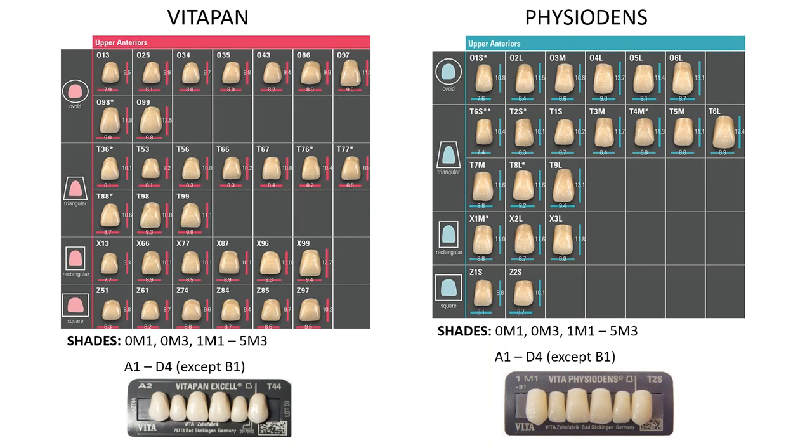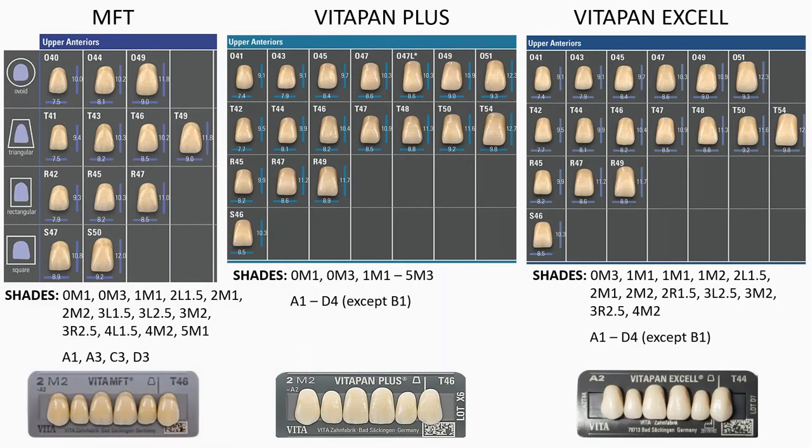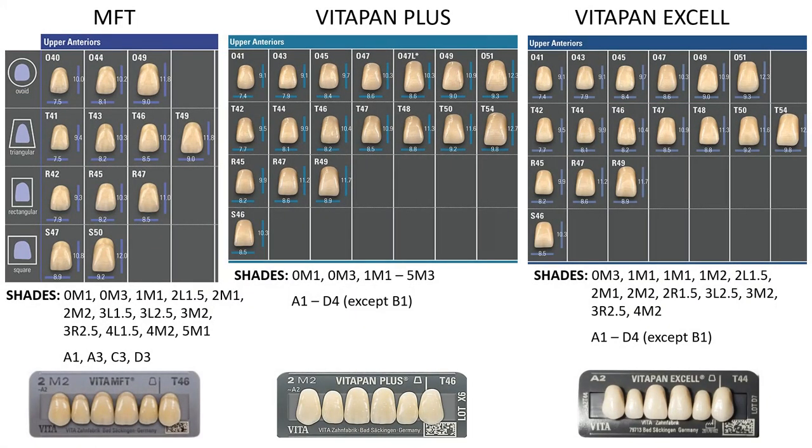And I think you can, again, look at all the prescriptions you've ever had in the past, and you can narrow down a nice selection of molds and help guide your patient or your dentist or your customer into certain shades, into certain molds. But as an individual, we've got plenty of molds to fit whatever that individual patient may require, along with the different shades and so forth. The only shade that VITA doesn't make is B1. And that's because we usually have a 1M1 in the 3D Master, which is a B1 as well.